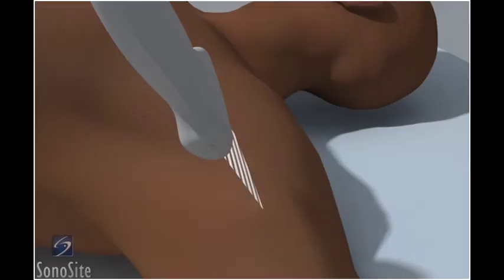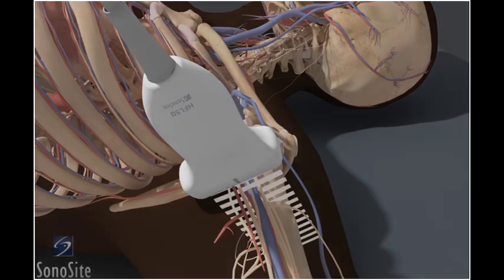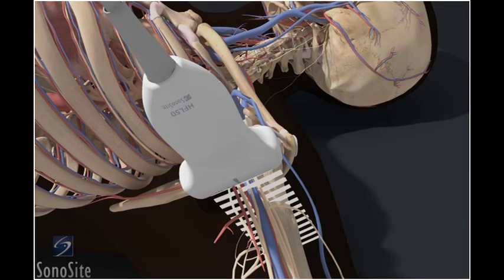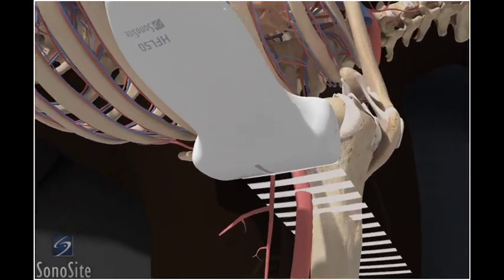The patient is positioned supine with the arm abducted 90 degrees and the elbow bent 90 degrees. The transducer is placed as high as possible in the axilla with the orientation marker directed to the patient's head. Slowly slide the transducer in a lateral to medial direction to identify the axillary artery.